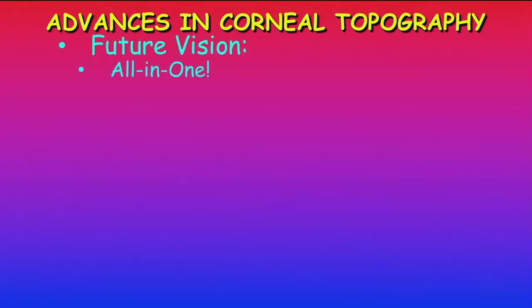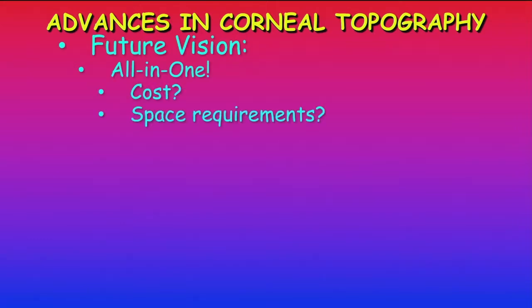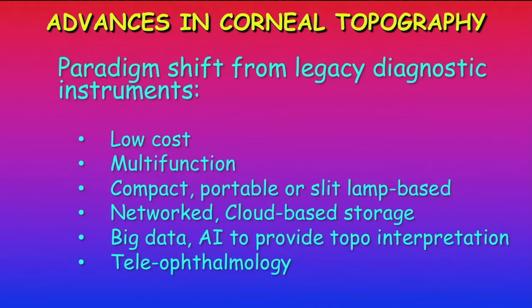Gee, what if we could put that all in one box? Well, who's going to pay for it? It'll be very expensive to build, and this box, at least nowadays, will be the size of the exam room. So that's a problem. But what I predict, though, is that there will be a paradigm shift from the big box legacy diagnostic instruments.